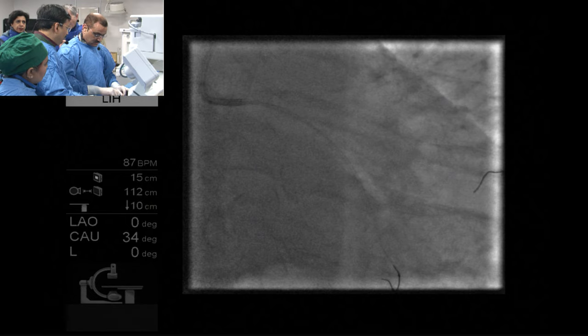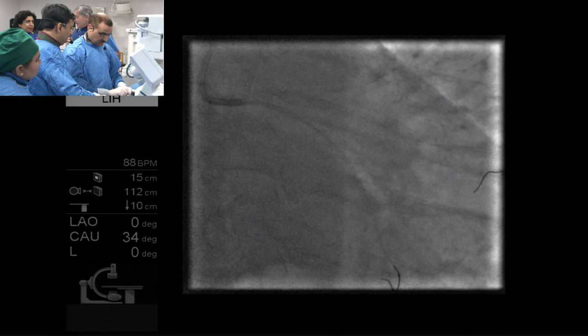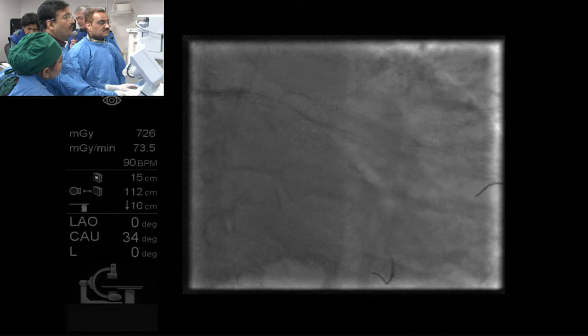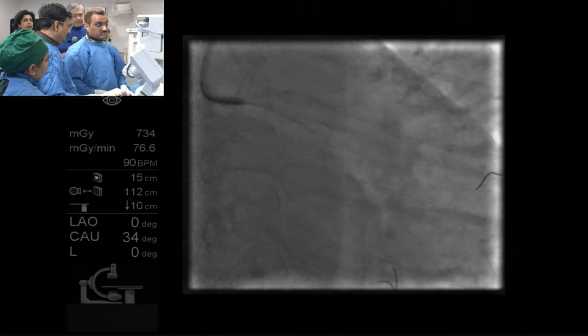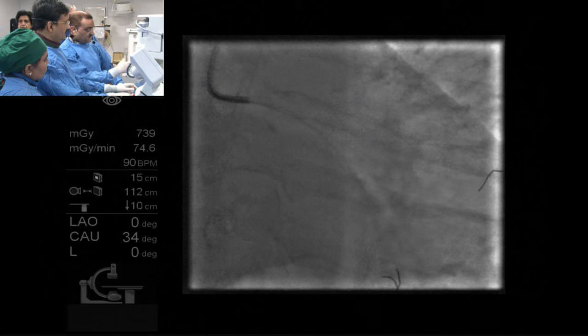Okay. Yes, sir. While he's changing equipment, why don't you describe the trapped balloon technique? Maybe the young operators don't know about that. Trapped balloon technique? Right, yeah, for the stenting, to keep the ostium open. To exchange a wire out from a short wire to a bigger one. Let's take a picture. I want to see that distal vessel. Can you come with the RO?